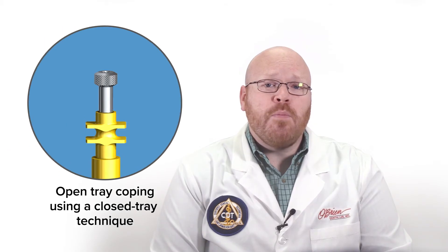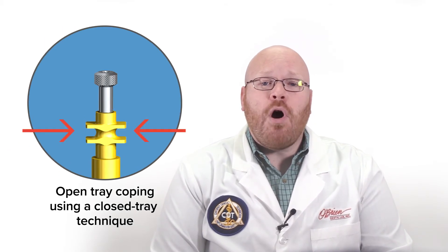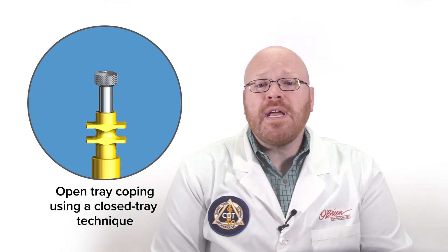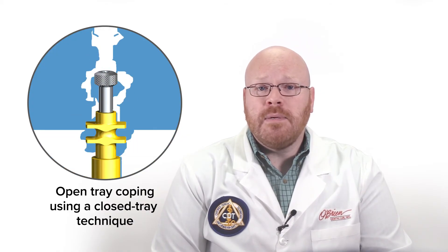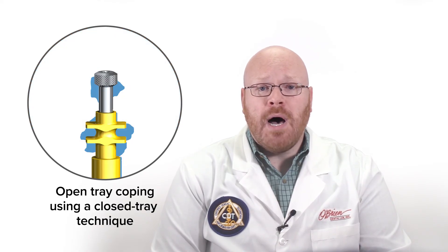Open tray impression copings are designed so that they are not easily removed from the impression. They have hard edges and deep features that provide retention and allow the impression material to lock them into place. If an open tray impression coping is used with a closed tray technique, the coping will rip through the impression material when the impression is pulled. This will reduce the accuracy of the impression if the lab tries to reinsert the impression coping to pour up the model.